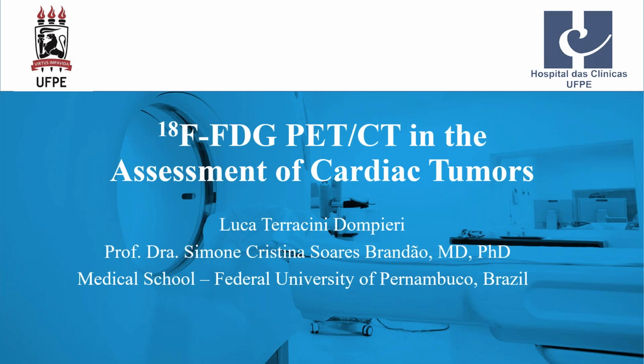So on the day of the exam, you avoid administering insulin to the patient, because the insulin puts the glucose inside the cell, the myocardial cell, and it's not good. So it's very important to control this kind of situation. The fasting is very important.